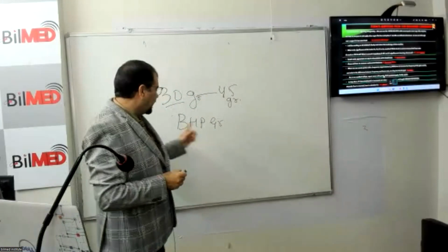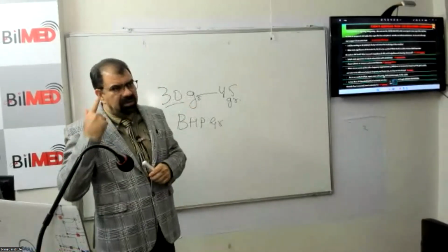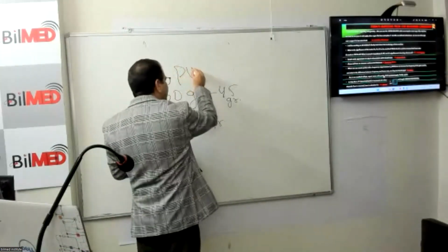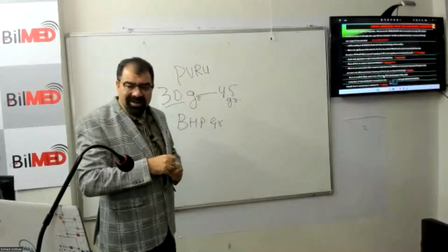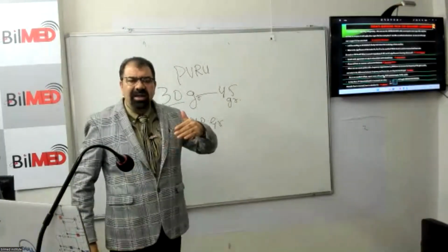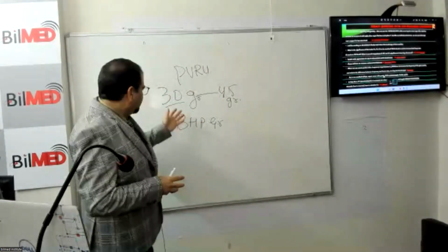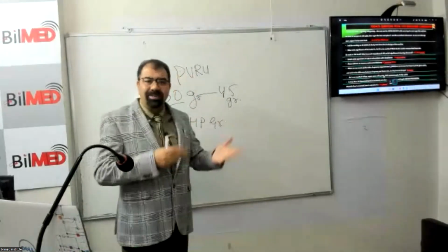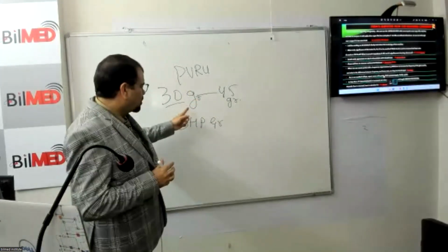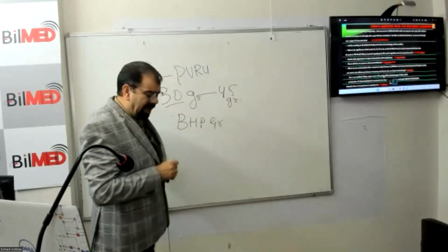So better not to give the grading, but you have to give the weight of the prostate, because the consulting doctor will correlate it with age and post-void residual urine. Because if post-void residual urine is more, but the prostatic weight is less, then it can be an advanced grading. So we have to see both the weight as well as the post-void residual urine to label it. That is not your job. That is the job of the urologist. So you give the post-void residual urine with the prostatic weight, but before post-void, you have to give the pre-void also. How much has to be post-void?